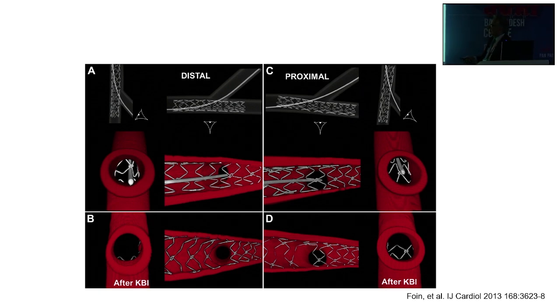So you see the stent here is hanging because we went proximal, so there is a lot of metal hanging in there, versus if you open it the other way, you do not have this. So that is the rationale for doing that. Again, it is not always possible, and you will cross whatever the wire allows you to cross, okay?